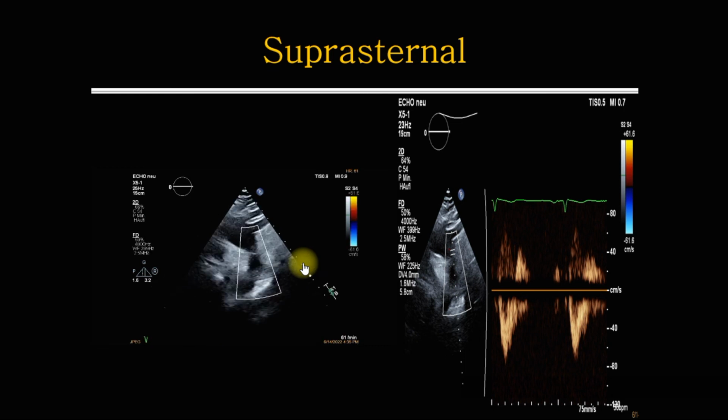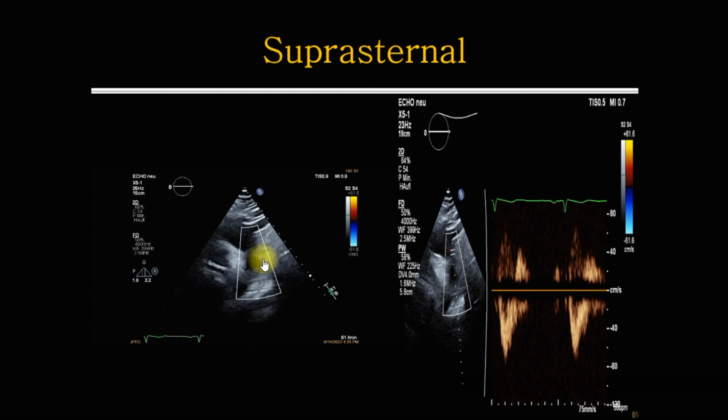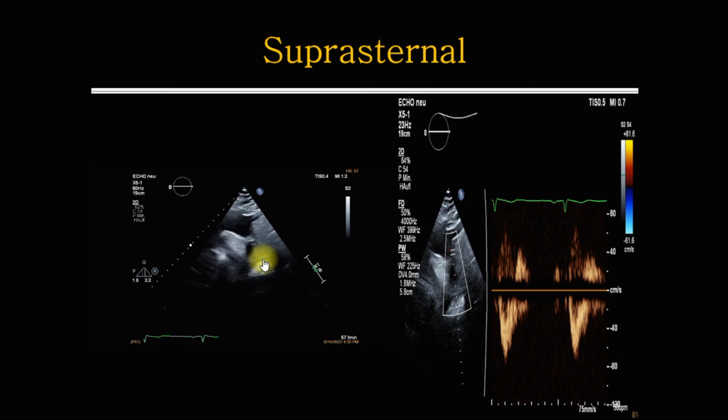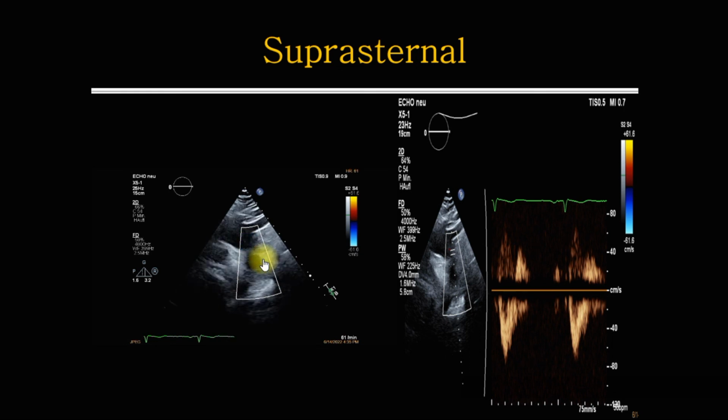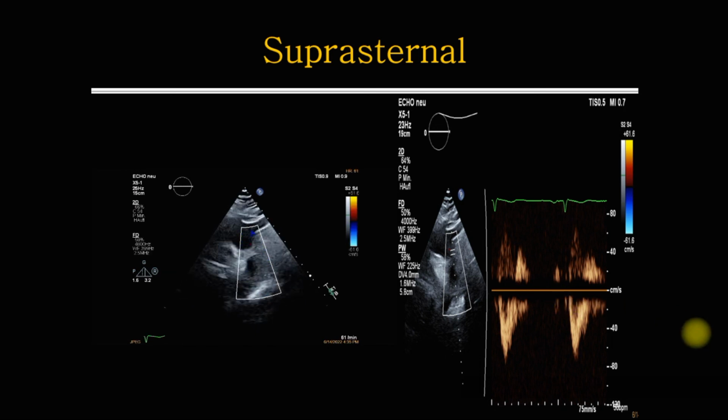Second important thing we can obtain from here, if the patient has an aortic dissection, we can see sometimes here a dissection flap. We can see also when a patient has a patent ductus arteriosus. This can be easily seen from this view. If the patient has coarctation of the aorta, can be seen from this view. And these important things we can discuss in further lectures.